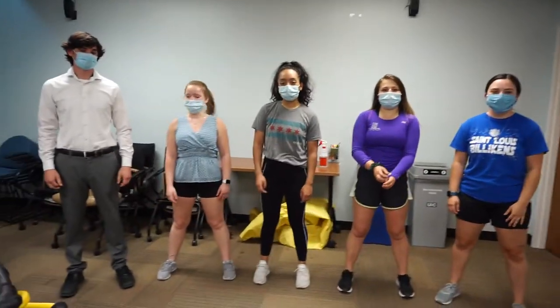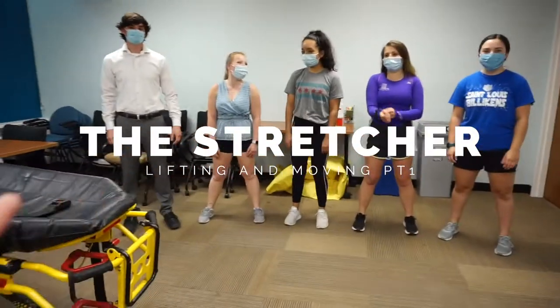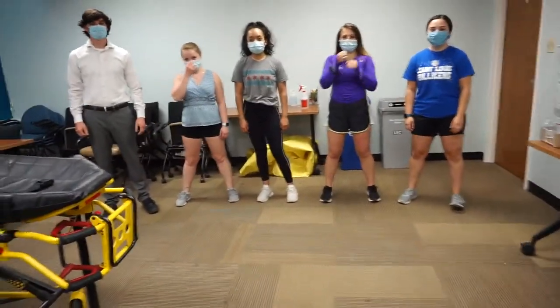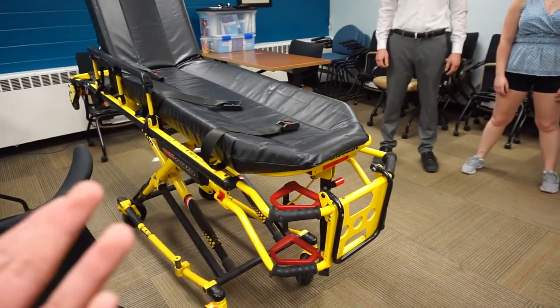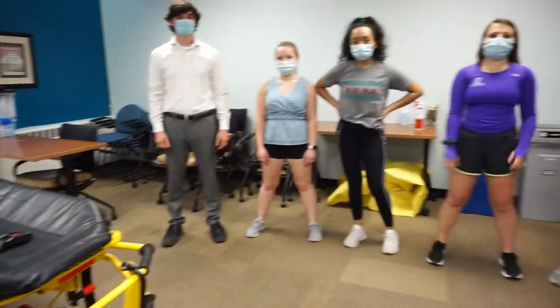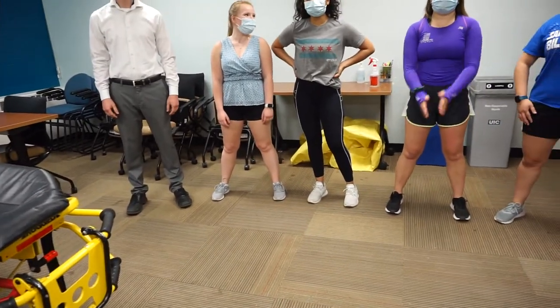We've got a lifting and moving video. We're going to eventually go into the stretcher, but we're going to start off with body mechanics and which parts of our bodies we utilize to actually lift a patient. Each EMT is expected to lift on average 150 pounds, including the equipment.